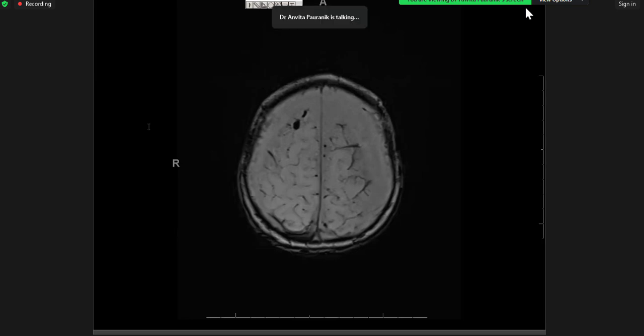Is it compulsory to do plain study for all before proceeding with contrast? So in terms of CT, yes, for sure. With CT, we always start with non-contrast CT head. I can't think of any scenario where, even if the question is rule out venous sinus thrombosis, I do contrast only. No, that's never the case. You can do both, but non-contrast CT is extremely important.